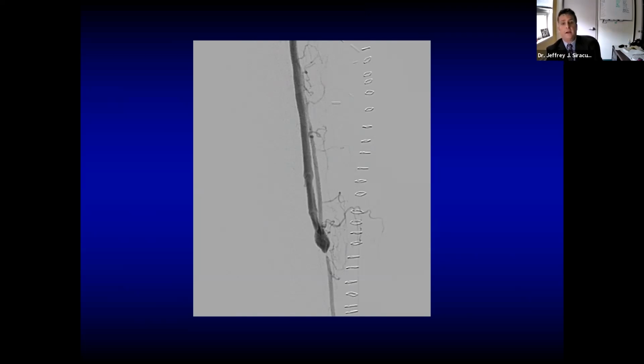You clearly see here my beautiful vein coming in, going to the posterior tibial artery, but then it goes nowhere. Really the only reason this bypass is still open is because of retrograde filling and some collaterals filling the artery distally. Clearly, this is my Yasargil clamp that injured the vessel there.